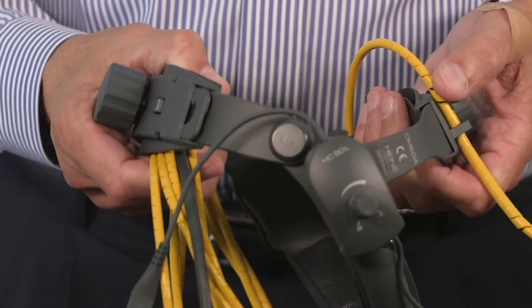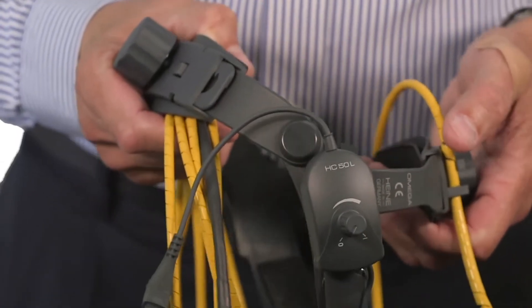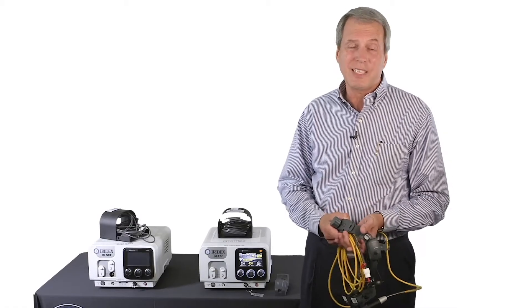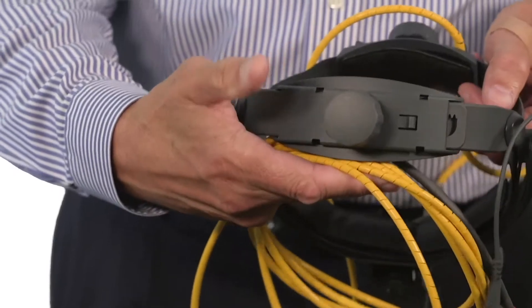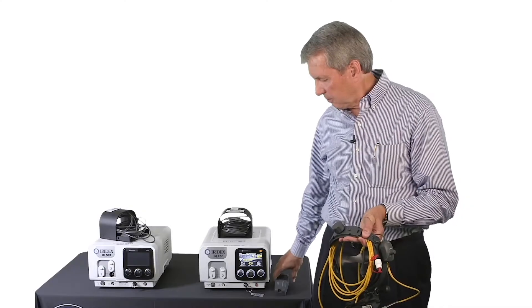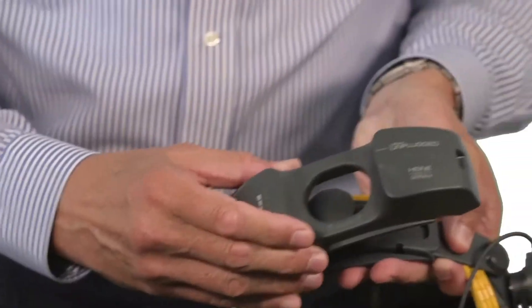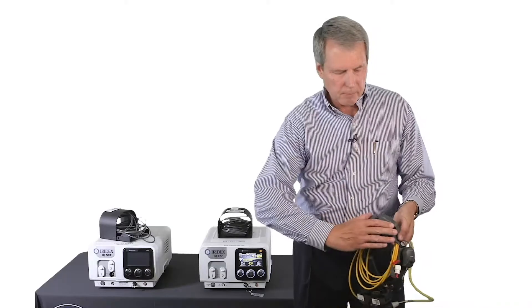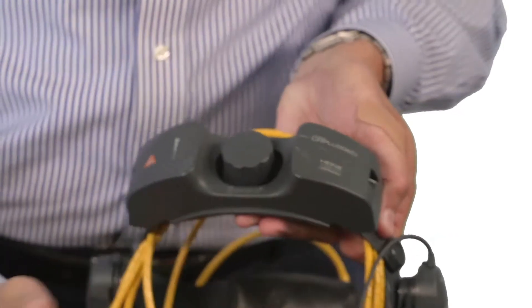As the new Iridex TrueFocus Laser Indirect Ophthalmoscope is battery operated, the first thing you'll need to do before using it the first time is attaching the battery. The battery attaches to the back of the headband by placing it over the band adjustment knob and locked into place.